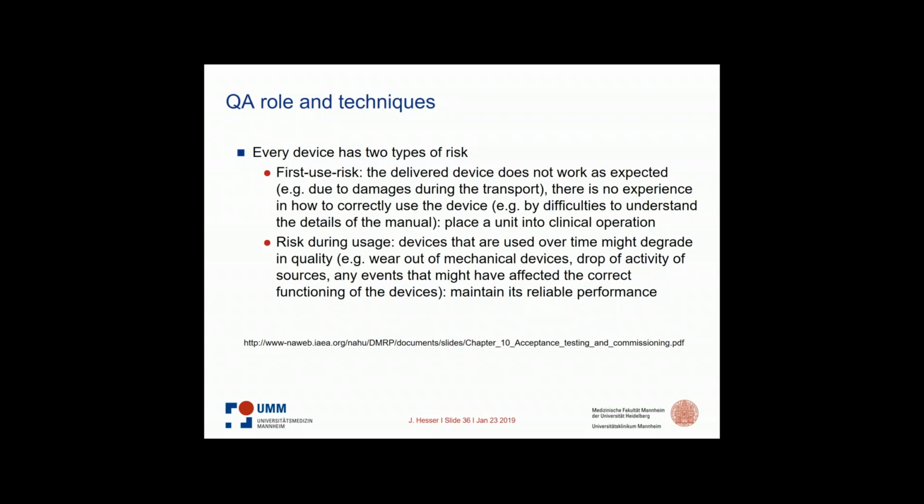For example, during transport it might be damaged, or the staff has no experience of how to correctly use the device because they have never seen or worked with it. It might be difficult to understand the details of the manual and so on. So the first risk is placing a unit into clinical operation. The first treatment is associated with the first use.